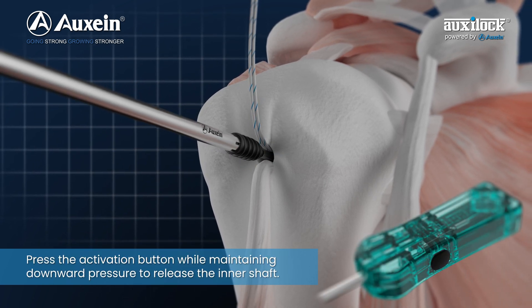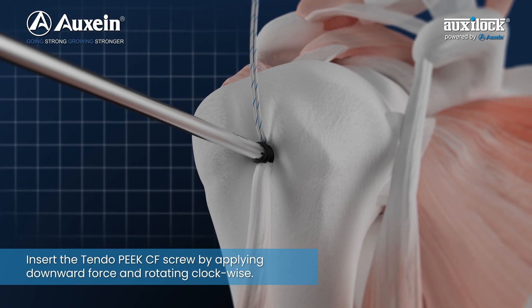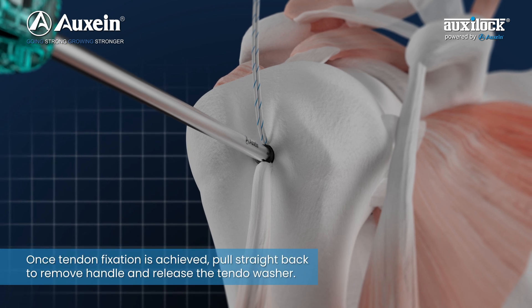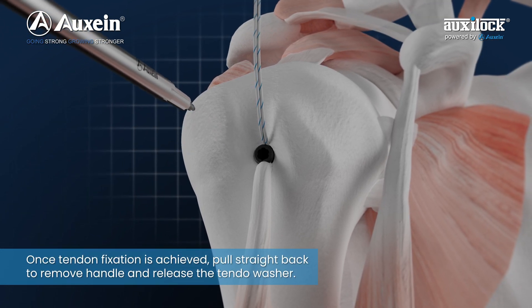Press the activation button while maintaining downward pressure to release the inner shaft. Insert the Tendo Peak CF screw by applying downward force and rotating clockwise. Once tendon fixation is achieved, pull straight back to remove the handle and release the Tendo washer.